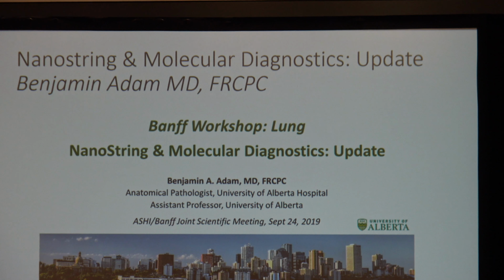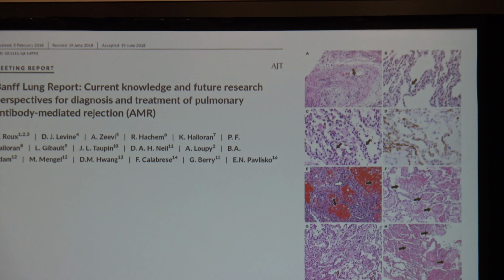the lung. So moving into the next part of our talks, which looked at newer technologies. We all have heard a lot about NanoString technology, and Dr. Ben Adam out of the University of Alberta took us on a really nice tour of some of his work, and he took his orders from the last Banff report, or at least it appears that he did.